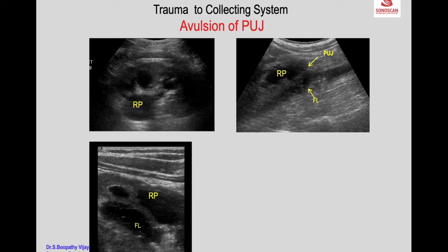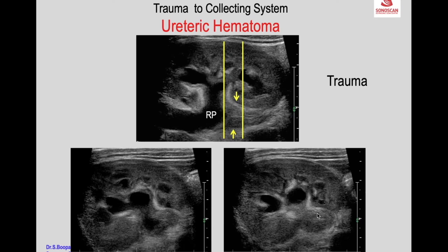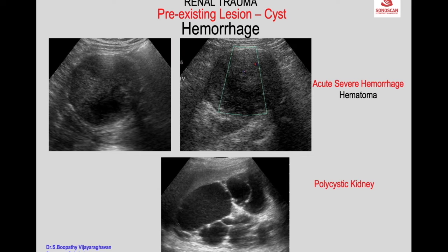There is a urinoma, and in the ureteric wall the entire lumen is obliterated by a submucosal hematoma. This can happen in trauma or it can be spontaneous. Here is an example of a polycystic kidney where one of the cysts shows mild hemorrhage seen as internal echoes.